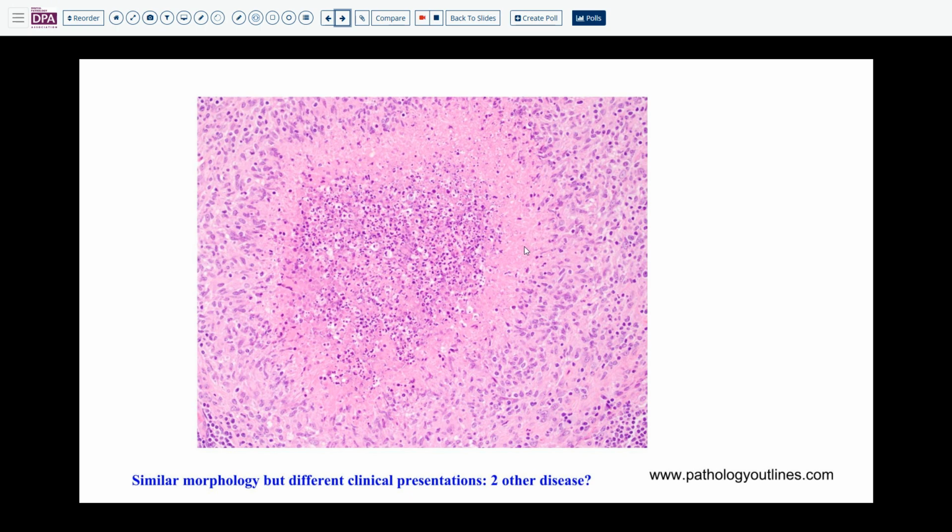Lymphogranuloma, yes, there's another scenario that should be STD, right? But I say this is a 15 year old boy with right lower quadrant pain. The clinician is thinking about appendicitis, but the CT scan does not show anything wrong with the appendix, just this enlarged lymph node, and then they do a biopsy.